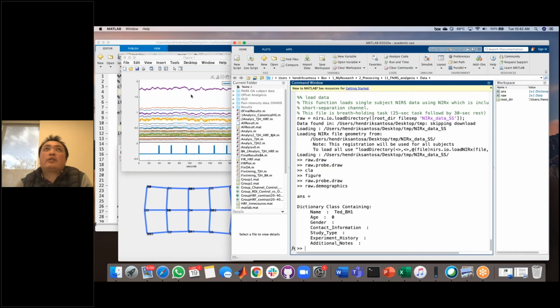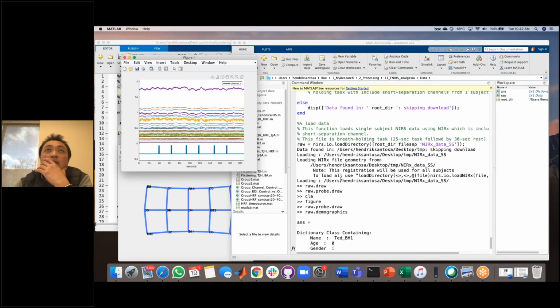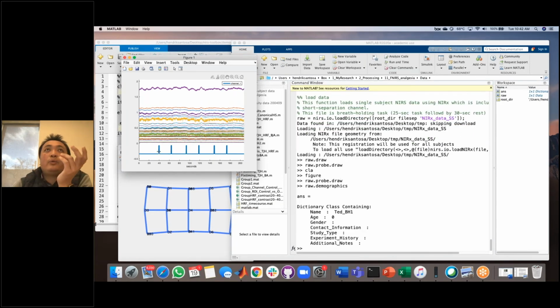Okay, so this is breath holding data. This is breath holding data from a subject. This is stats data. So you can see this is when I asked them to hold their breath. This is start and this is end. This is start and end. The data looks good. So the limitation of this study is the data is too good because there is no outlier even for the walking task, because the NIRS X cap is good.